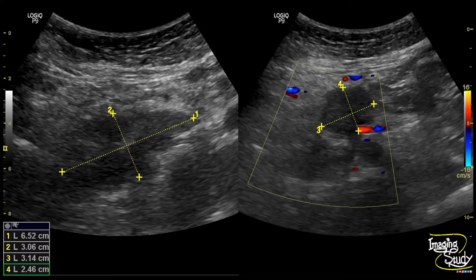Here are the measurements showing the hypoechoic pancreatic head mass on the right and the collection on the left. This heterogeneous collection is bounded by a thick hyperechogenic fatty area, which indicates fat stranding due to the inflammatory process.